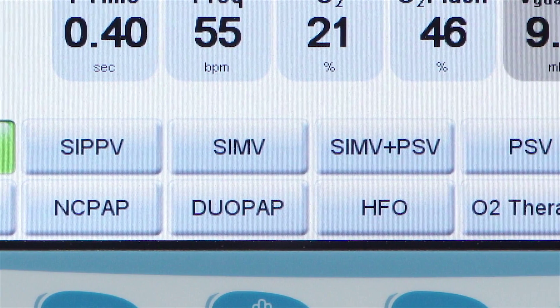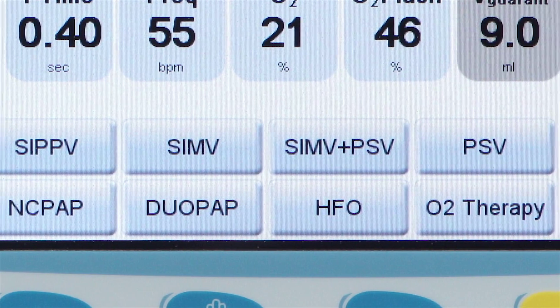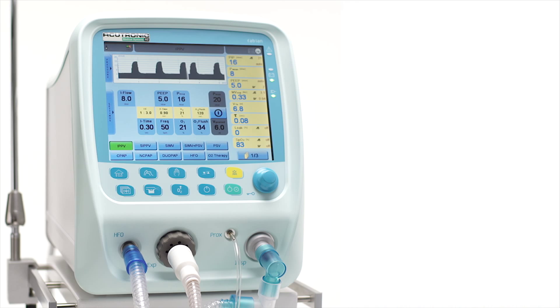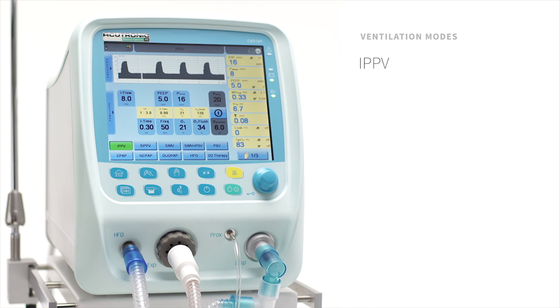Select one of the following ventilation modes according to your needs. IPPV, Intermittent Positive Pressure Ventilation, same as CMV, IMV, or TCP-L.